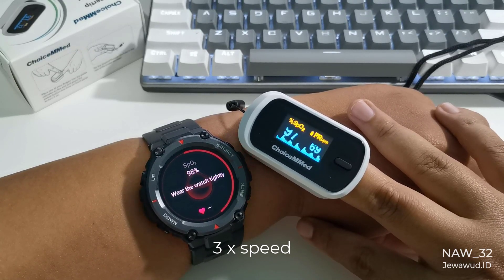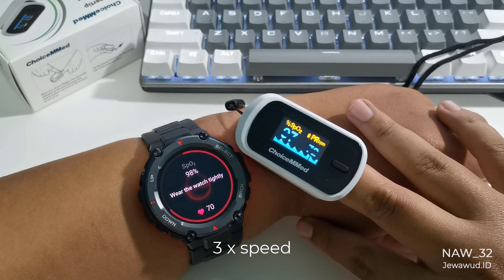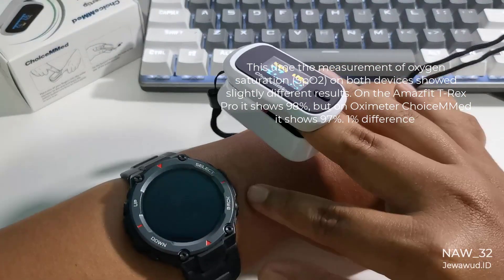This time the measurement of oxygen saturation, SpO2, on both devices showed slightly different results. On the Amazfit T-Rex Pro it shows 98%, but on the ChoiceMED oximeter it shows 97% — a 1% difference.